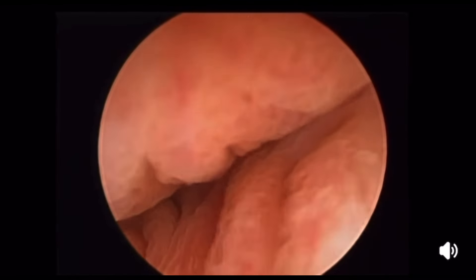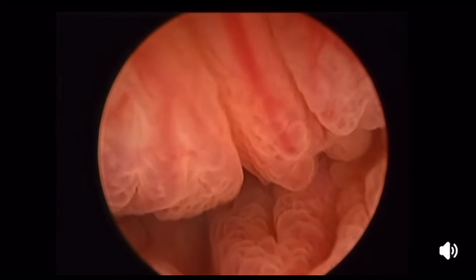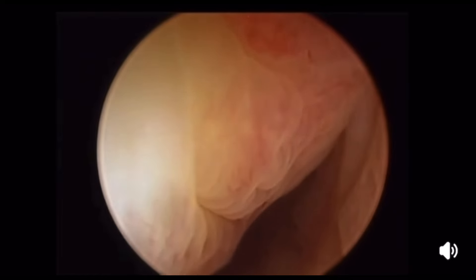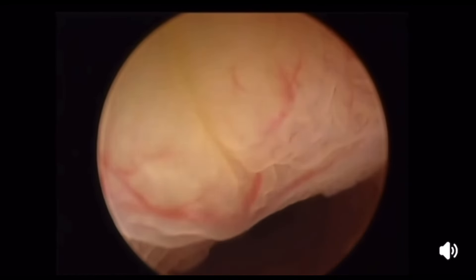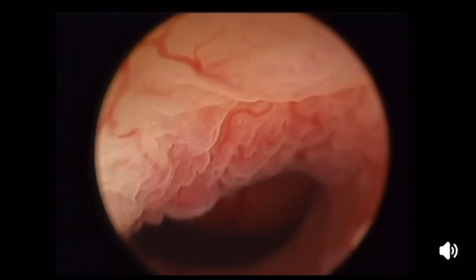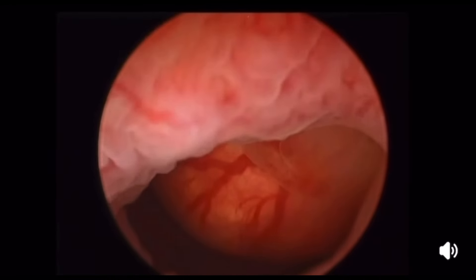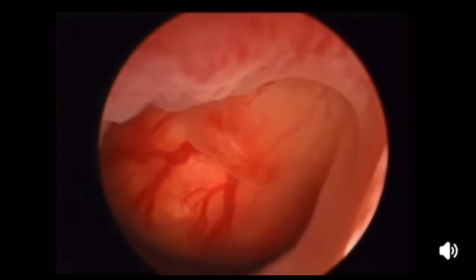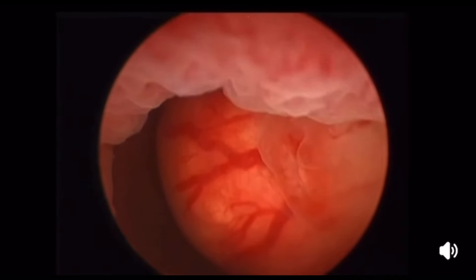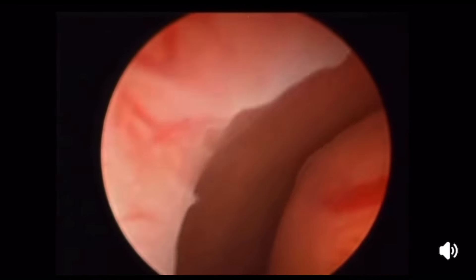Let's share together, step-by-step, a non-edited full procedure of a hysteroscopic myoma resection. I always repeat that success in accessing and entering the uterine cavity is the most important step before you start the operative procedure — because if any friction happens, or hitting the myoma or the pathology, shredding and bleeding will occur. This small cavity is difficult to clean; it's not like laparoscopy. Observe here how very gentle, smooth, and easy access to the cavity of the uterus is achieved.